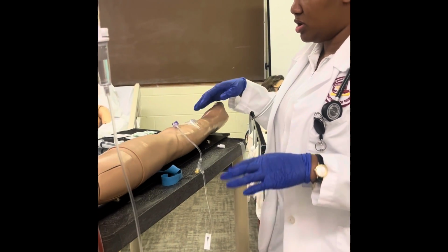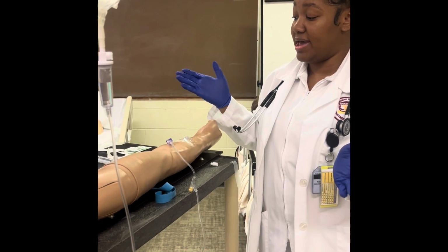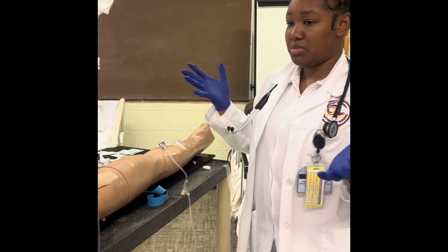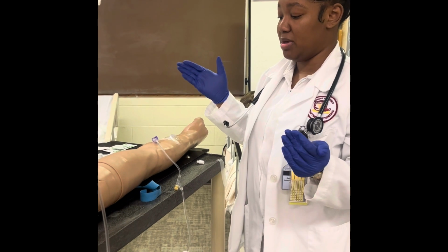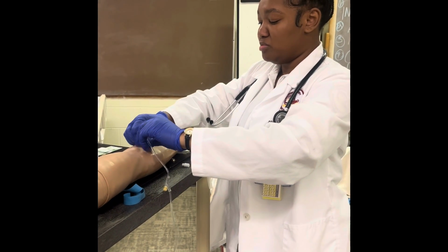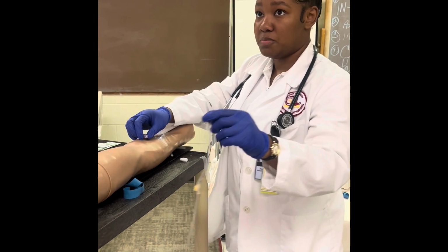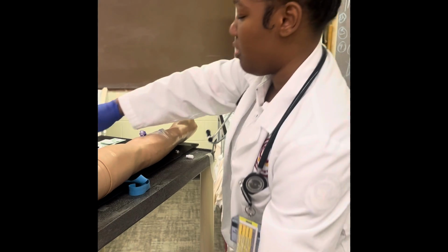Alright, so now this is a little later, and now my patient has an order for an IV push medication. Again, I'll come in here, perform hygiene, put on gloves, check the MAR, make sure it's the correct patient, correct order, dose, time, and route. So I would disconnect the tubing from the pump.